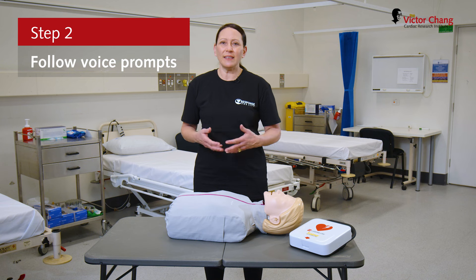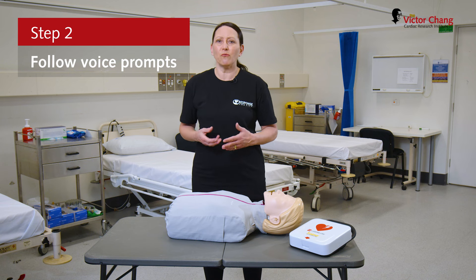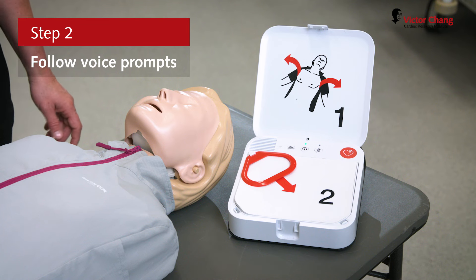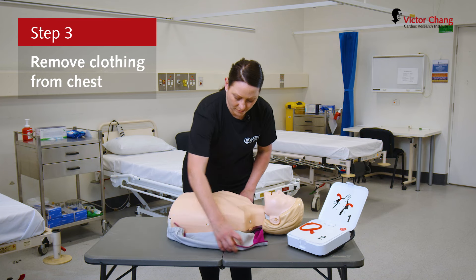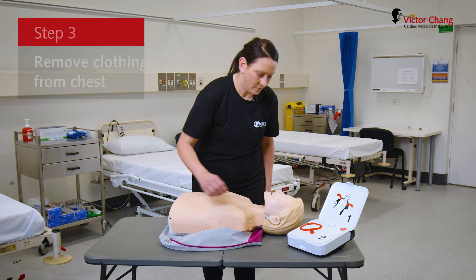The defib will give you really easy and clear instructions of what to do. Remove all clothing from the patient's chest. Pull the red handle to reveal the pads.